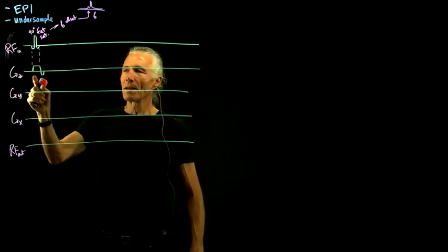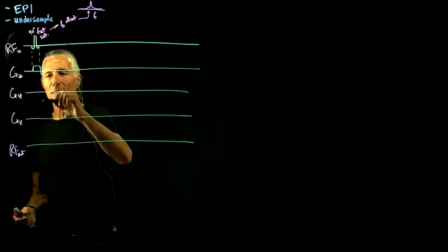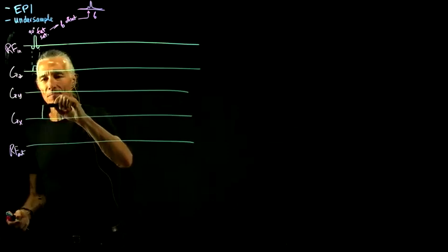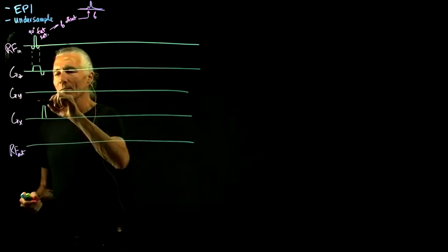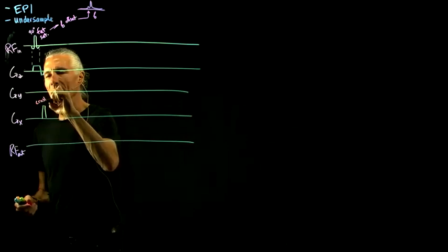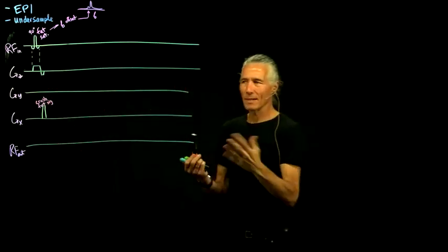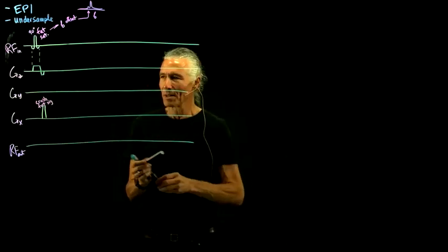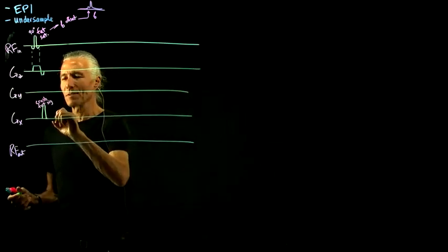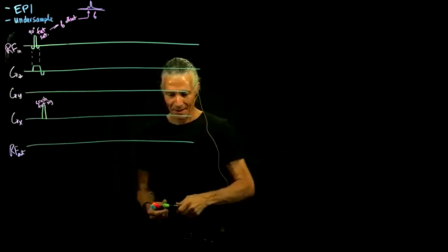But there's still some transverse there, and so we have to slam that transverse. And so what we do is we do a crusher here, on that gradient, to crush fat. So crush the fat signal. There's a transverse magnetization signal that we don't want to get into our recording. So we sort of wrap it up into 512 stripes, which is almost no signal. So that's the fat crusher.